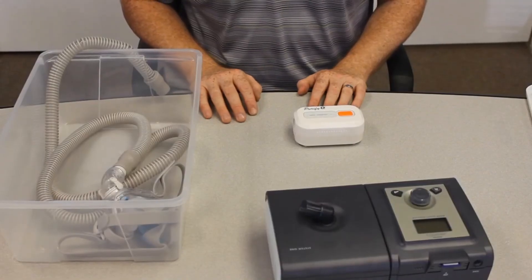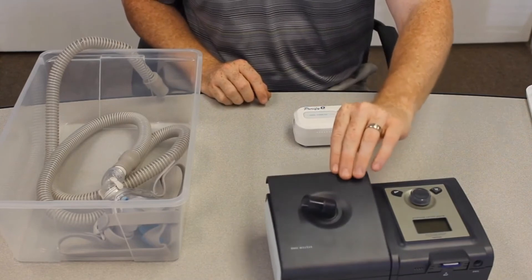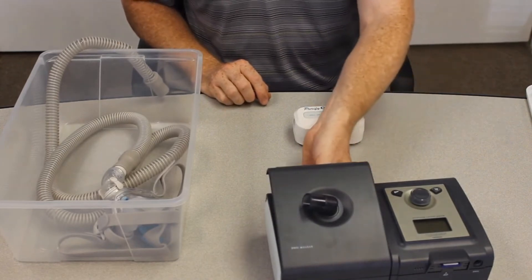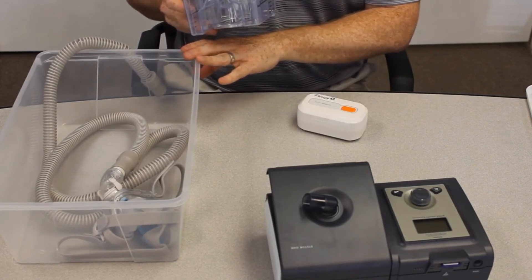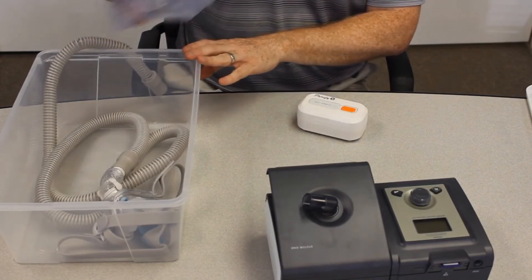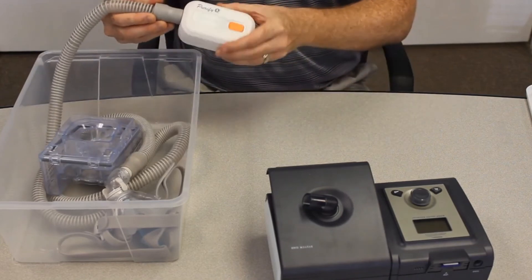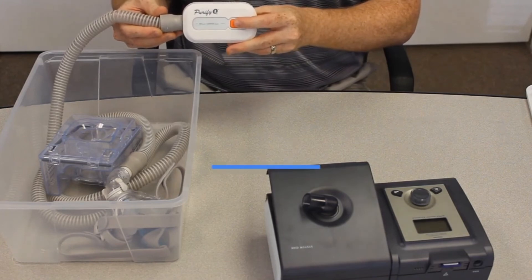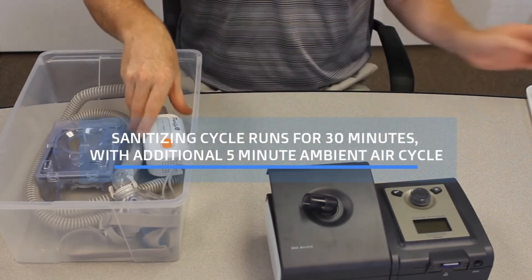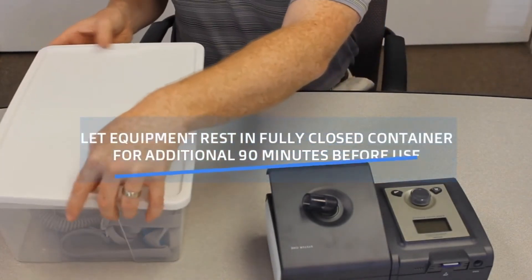So we've gone through the two cleaning cycles — the first for the mask and the tubing, the second for the humidification chamber. However, if you'd like to do both at once, go ahead and purchase a 12-quart or smaller plastic bin. Set all your equipment in there, connect your tubing to the Purify O3, turn the Purify O3 on, set everything in there, and seal the container.